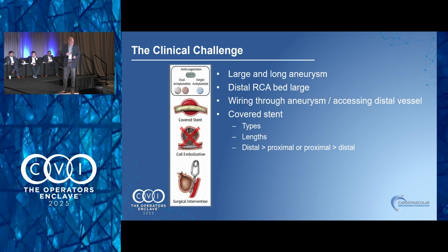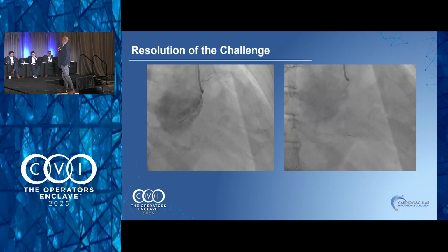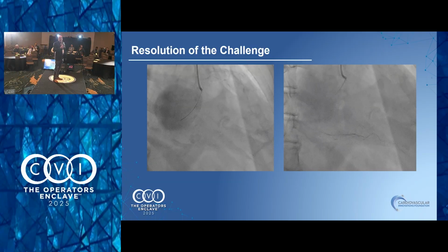All right, so this is what I did. I told everybody, wiring this is gonna be a bear, so just hang tight. So I used a microcatheter, and I wired it. Sorry, this should continue to play.